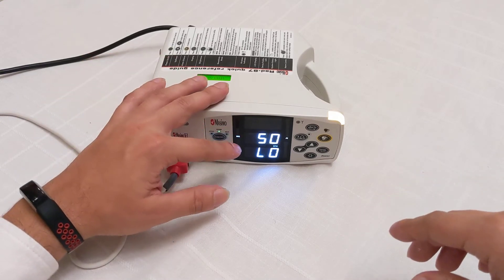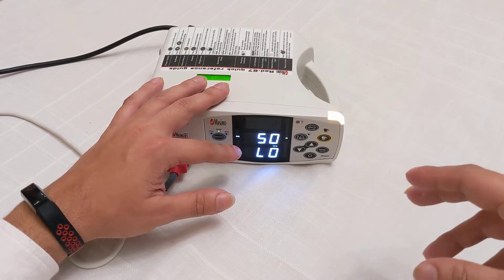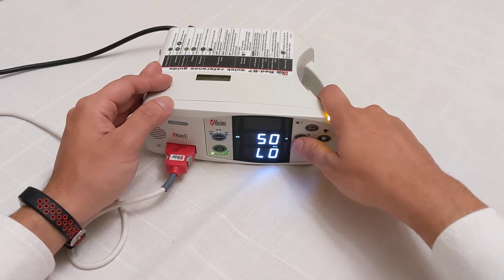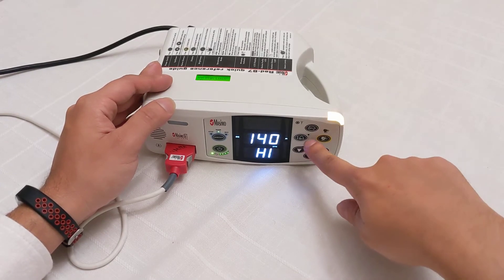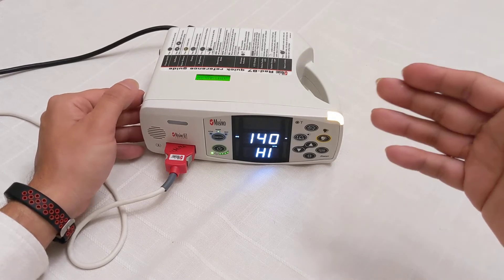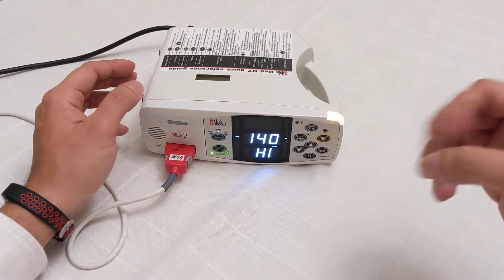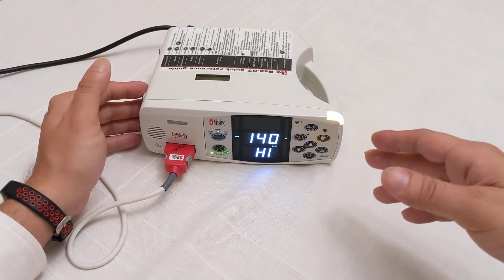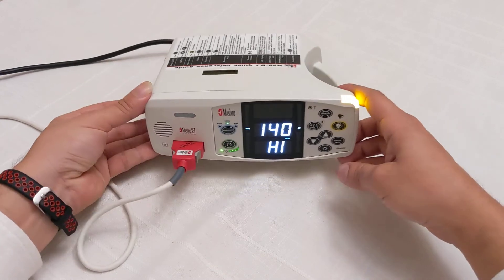The next one is beats per minute. The default for this machine is 50 — if it falls below 50 beats per minute, the machine begins to beep and it'll turn red. The next button gives you the high beats per minute: if your heart is over 140 beats per minute, the alarm will sound and alert you to what's going on.